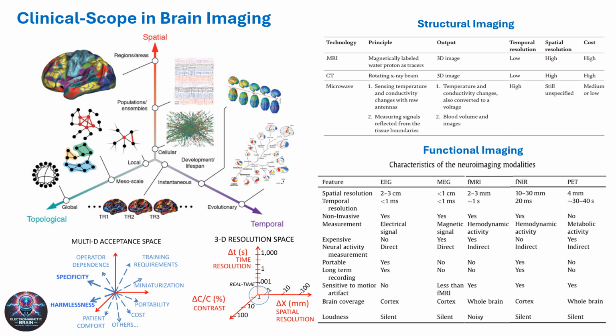It offers high temporal resolution but still has unspecified spatial resolution. One advantage of microwave imaging is that it has the potential to be less expensive compared to MRI and CT, making it a promising tool for broader clinical use.